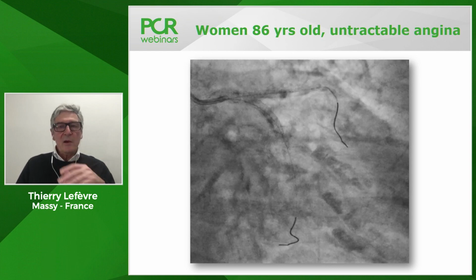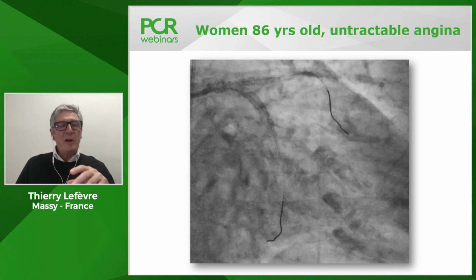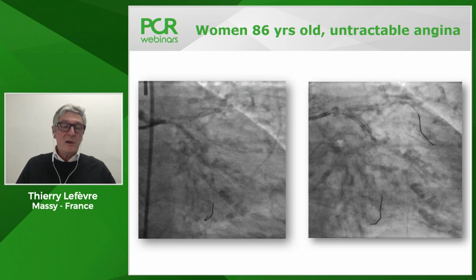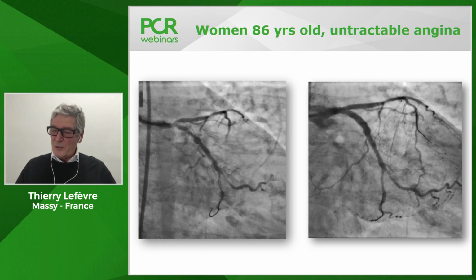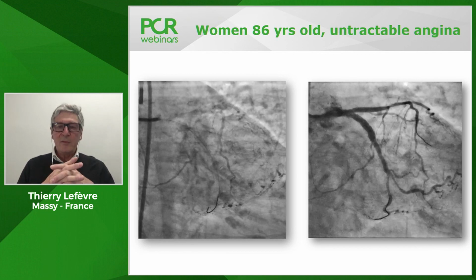I have to say that at the beginning of the procedure, with each balloon inflation, we had the pressure going down in a few seconds. So it's really, despite the intra-aortic balloon pump, and we saw the diastolic pressure increasing with the intra-aortic balloon effect. The final result looks very acceptable.